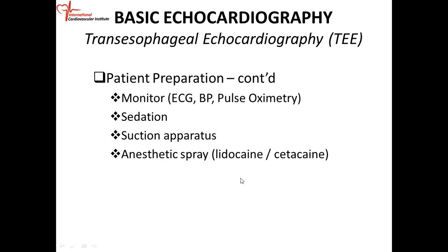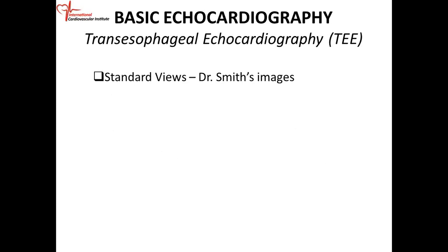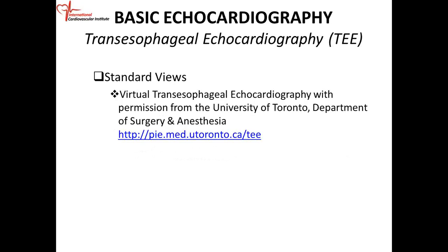You should anesthetize the patient's throat with either lidocaine or a similar agent. These are numbing medications that you can use to reduce gagging. You don't want to anesthetize the area too much, but you should use one or two sprays. Okay, so those are the indications, contraindications, and patient preparation for the procedure.